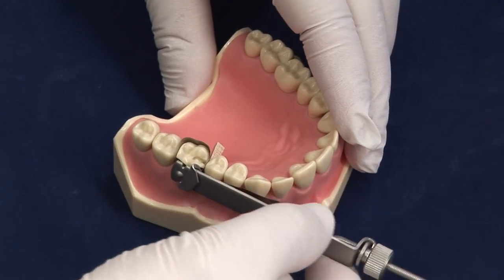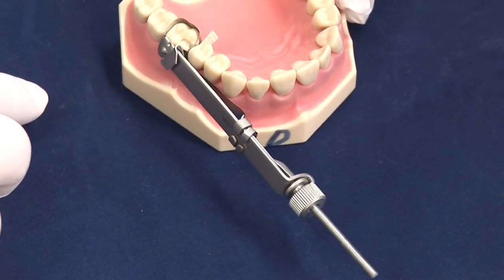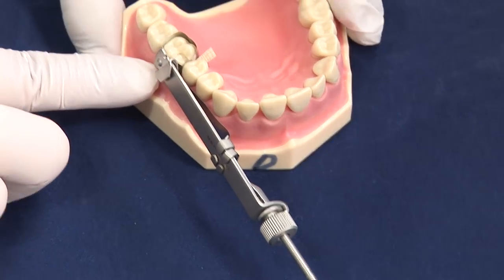The matrix retainer should be facing out of the mouth. The latch should still be in the gingival slot.